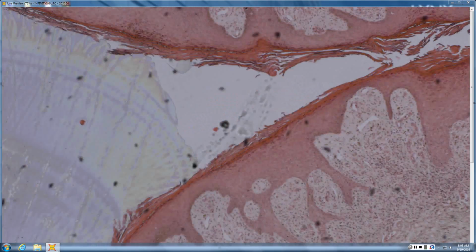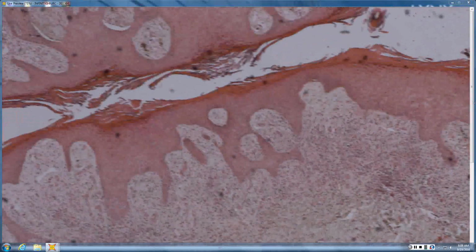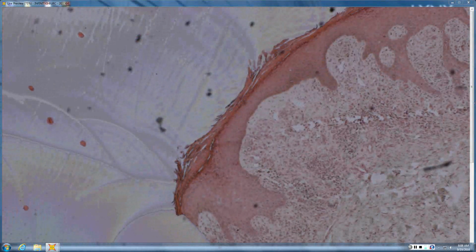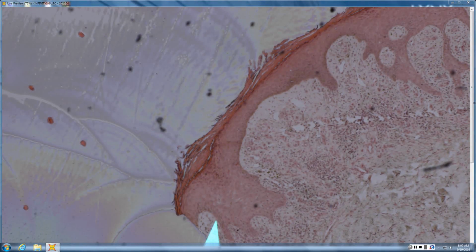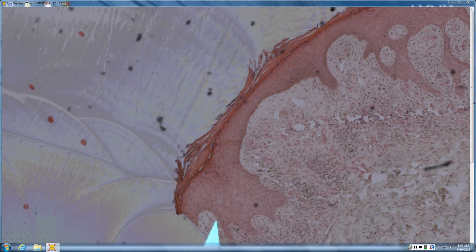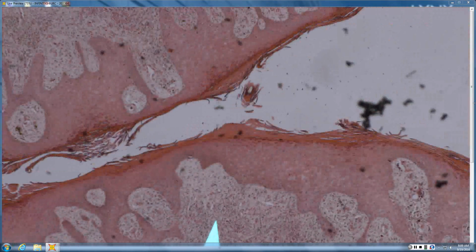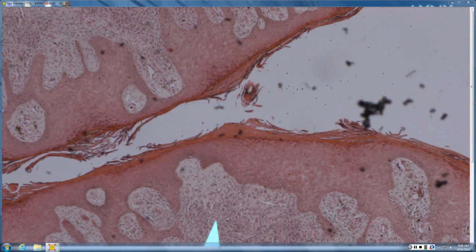I'm in the lichenoid interface because you have some sawtooth-looking rete. Yeah, and why is there so much PEH? Your surface epidermis isn't really participating, but your adnexal epithelium certainly is, hugely. So pseudoepitheliomatous hyperplasia in a lichenoid process. What's your differential? Syphilis, hypertrophic lupus, and LP, hypertrophic lichen planus.